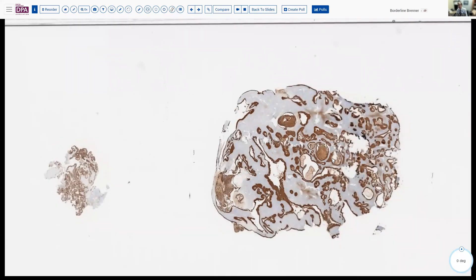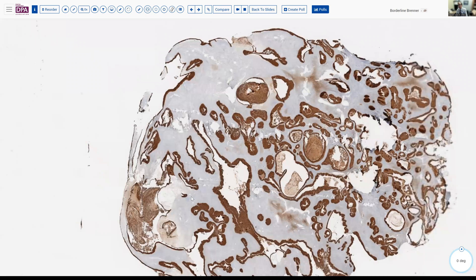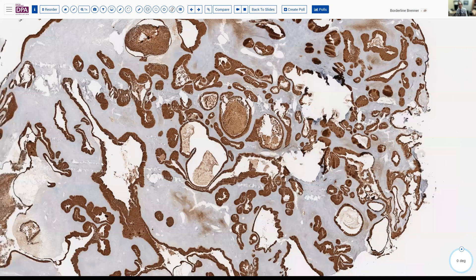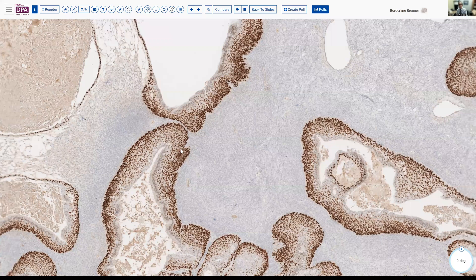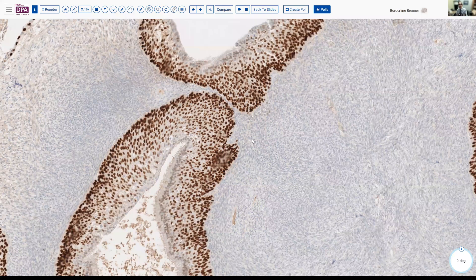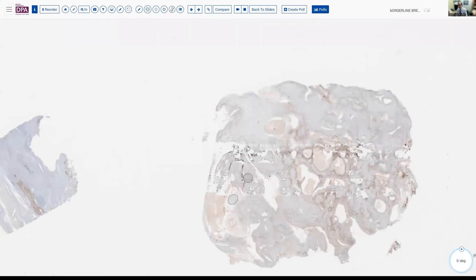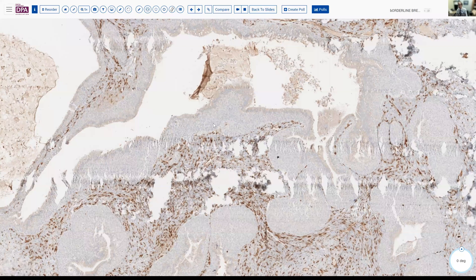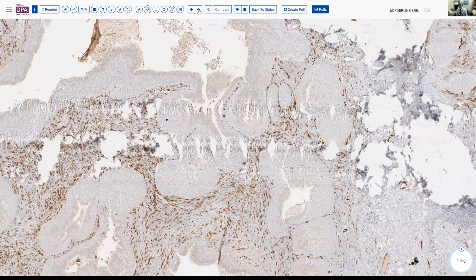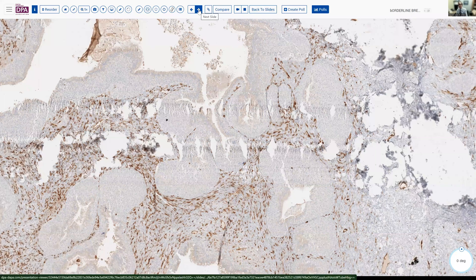We did perform immunohistochemistry on our case. Here's a nice image of the CK7, lighting up all of the epithelium — the basal transitional areas as well as the ciliated epithelium. Here is the P63, which seems to concentrate and differentiate between the surface columnar ciliated epithelium and the underlying epithelium, which is expressing the nuclear marker quite strongly. We also did a P16, and you can see that it is entirely negative — we see some stromal positivity in a few areas, but barely any cells express P16. We also did GATA-3 in our case, and it was negative. Given the preponderance of evidence, we felt the diagnosis was a borderline Brenner tumor.